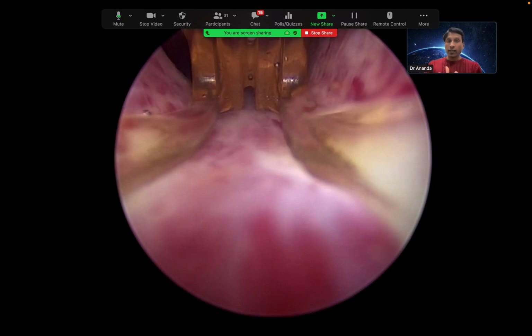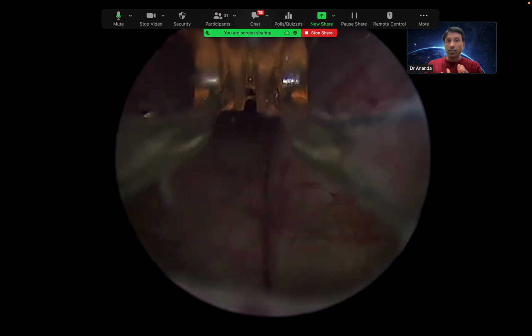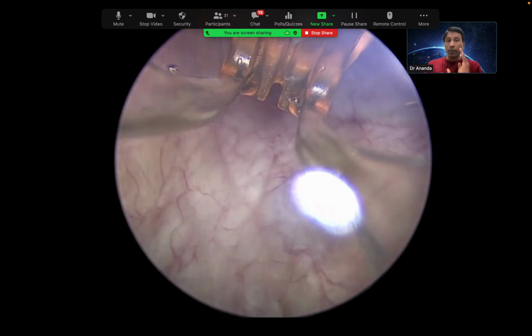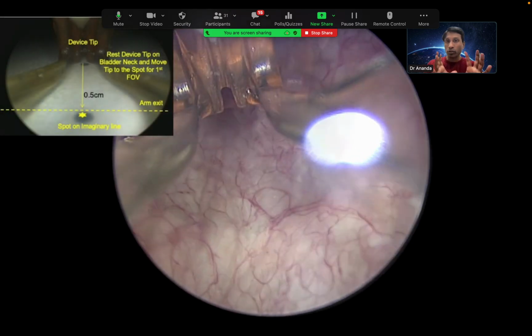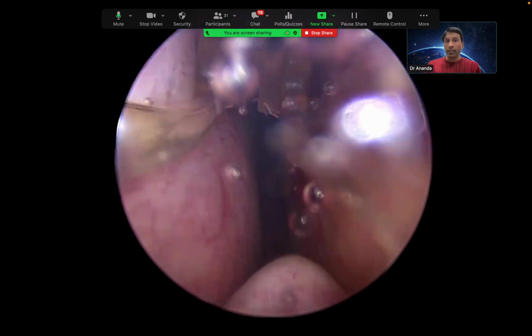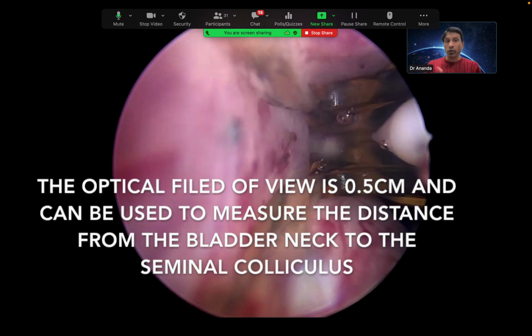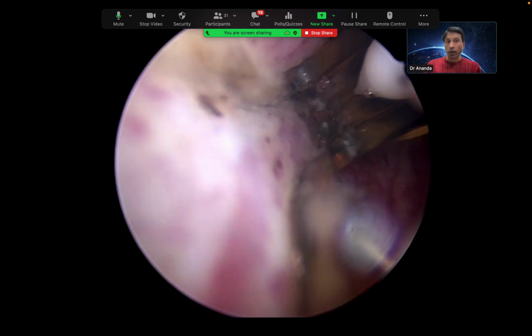So again you will have a fixed equipment delivery system. This is a disposable delivery system. The patient should have a normal cystoscopy, and then the patient's anatomy and suitability need to be completely assessed. And here you can see that the patient needs treatment on both left and right lobes. There is no need for a median lobe deployment.